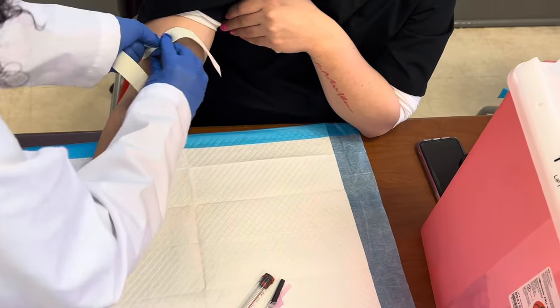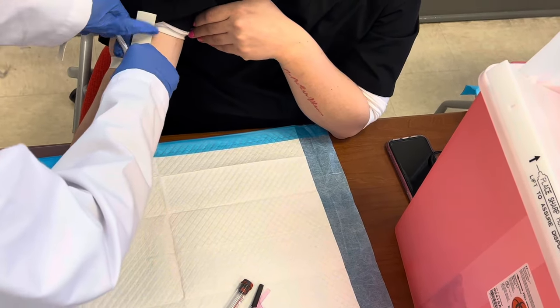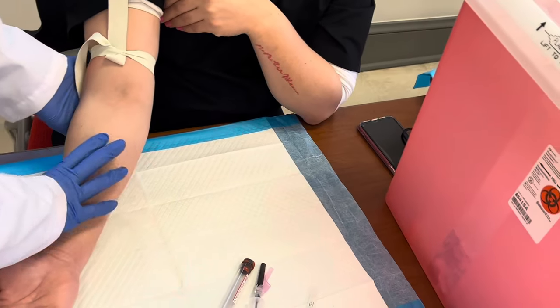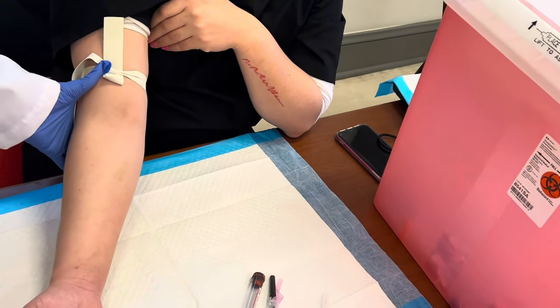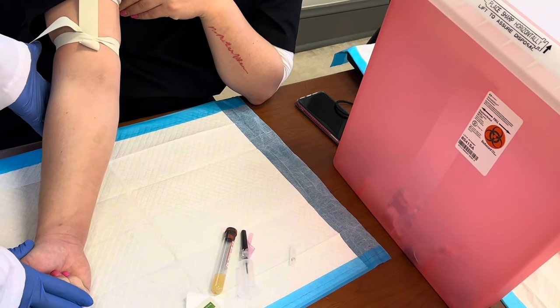You want to make sure your tourniquet is tight. You don't want to be so tight that it's hurting your patient, but you want to be tight enough to get those veins prominent. A couple different things you can do when you have a difficult patient — first of all, you want to get them to make a fist. We don't want them to pump, just make a fist.